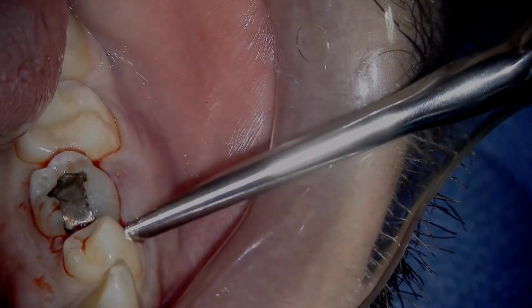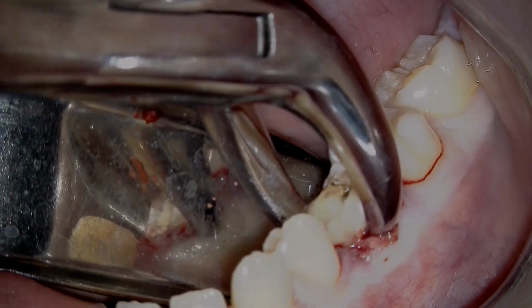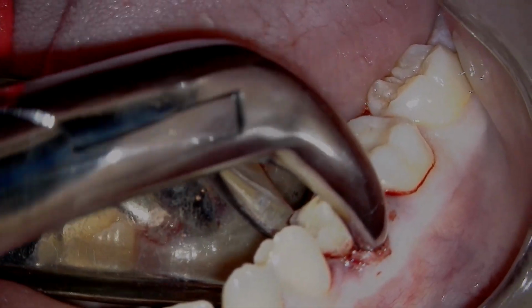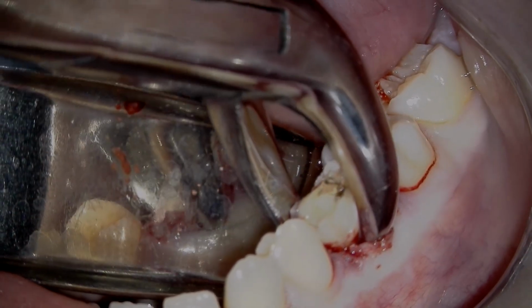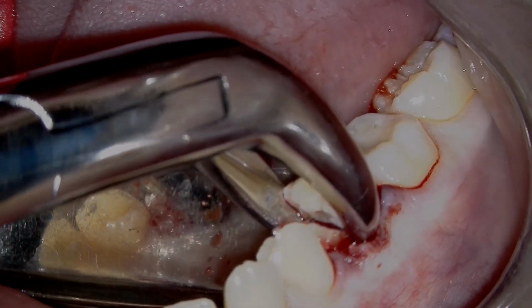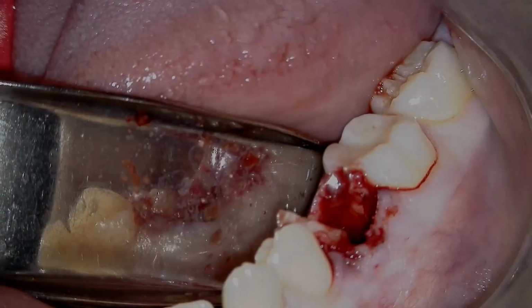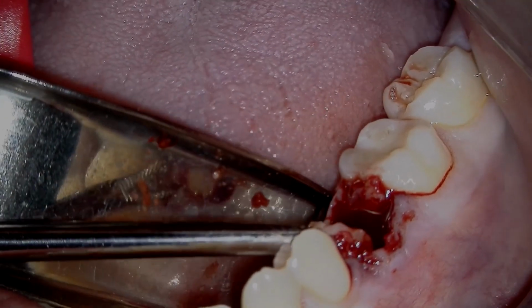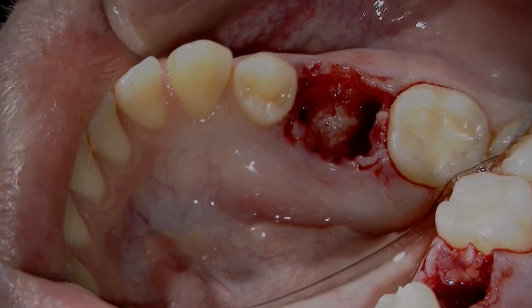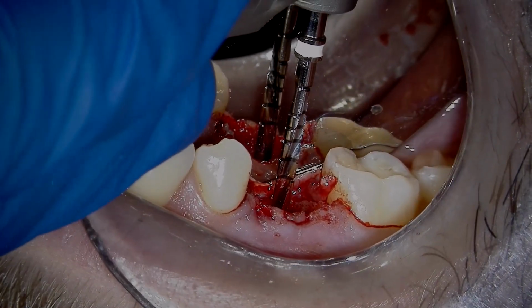Here we go. And I've chosen to use a 23 cowhorn forceps, place it in the furcation zone, and I'm just using a pumping motion. Basically because I'm trying to fracture this tooth in half. I want to separate it so I'm not really expanding any of the buccal or lingual plate, and I just want a straight lifting motion. So out comes the distal, next the mesial, and there's my site. And you can appreciate now the buccal and lingual plates are intact.